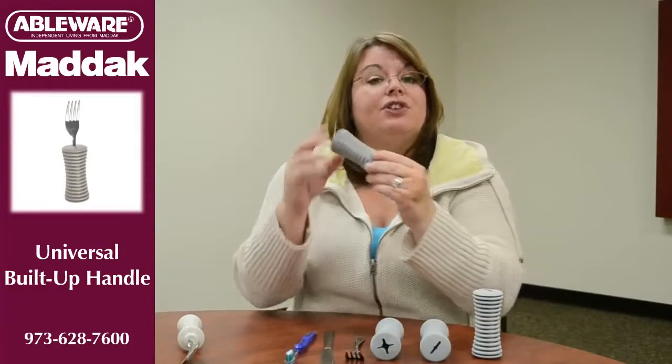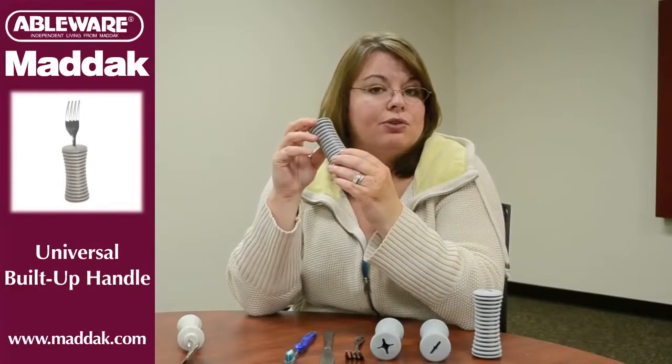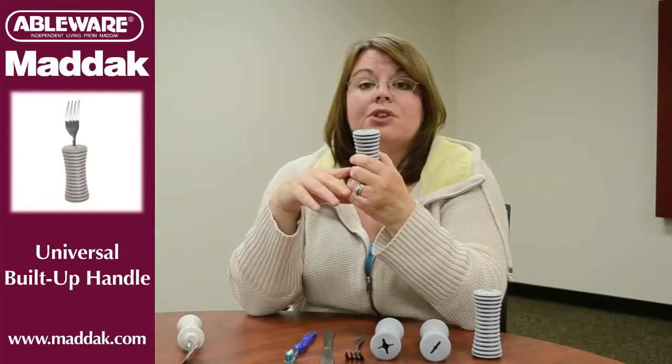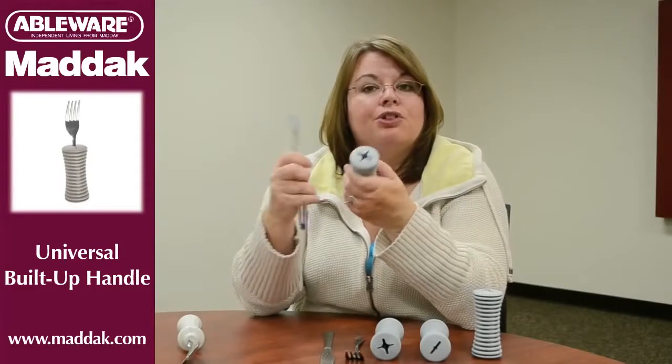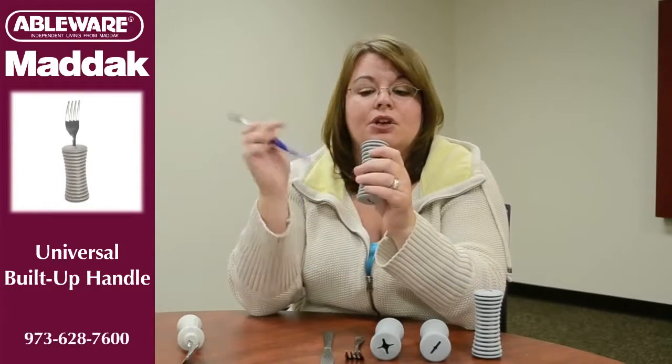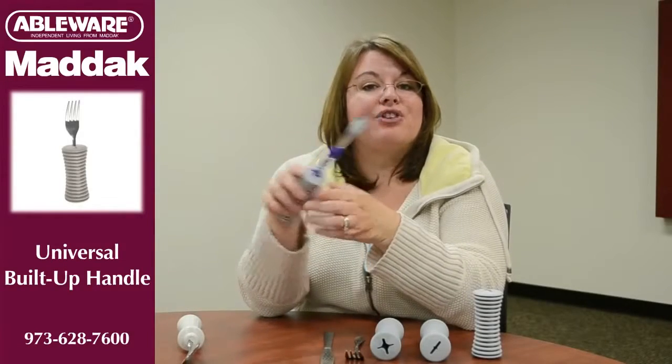Another advantage of the universal handle is that it can be used with other household objects, like a pen, a pencil, or a toothbrush. When using it with another object, just find the end where it fits best. For a toothbrush, it's probably the star-shaped end — just slide the toothbrush through the handle, and then you're ready to brush your teeth.